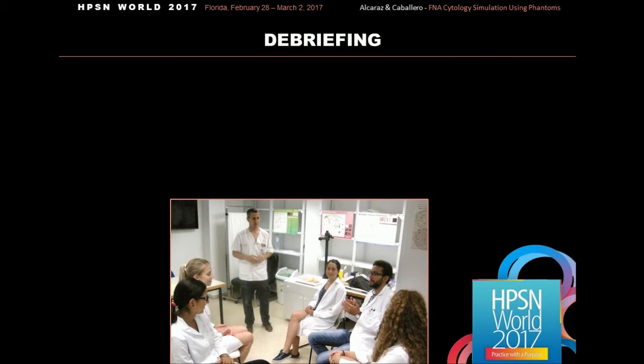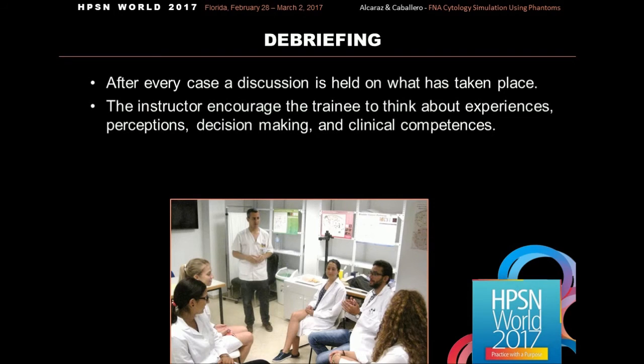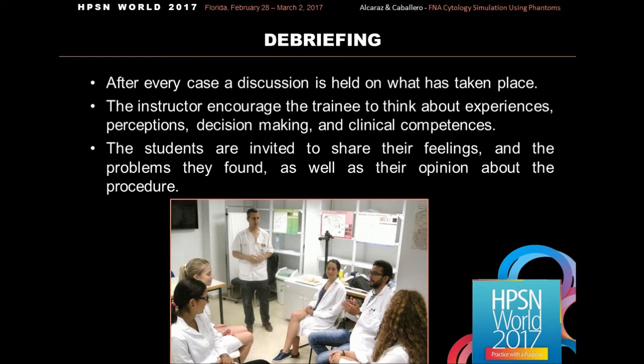Now, here comes the moment of the debriefing. It's time to be critical of everything we have done so far. After every case, a discussion is held on what has taken place in order to encourage the trainee to think about the experience, perceptions, decision-making, and clinical competencies. Students are invited to share their feelings on the problems they found, as well as their opinion about the procedure.